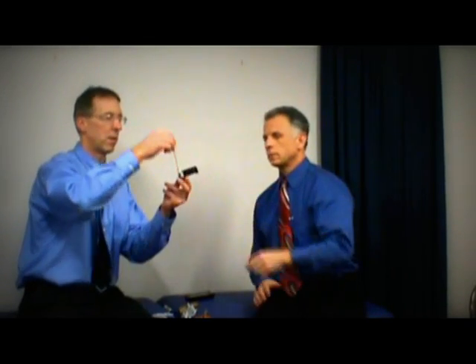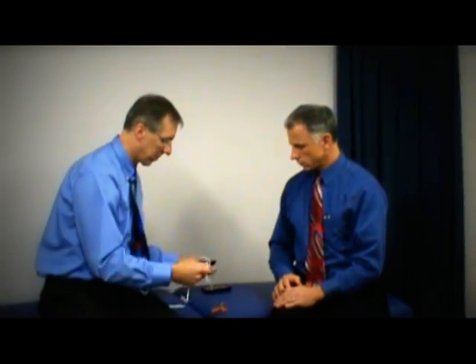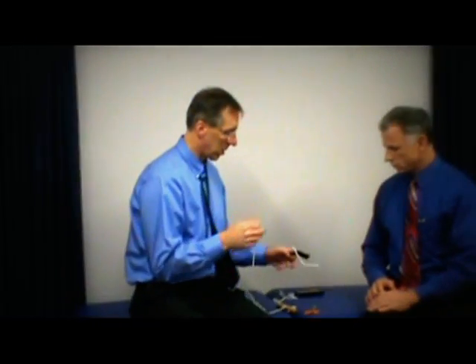You're going to show how it works? Yeah, we might as well. So pretty. So there's the pulley, that thing with Bob made the nice knot. I'm going to put 2 1/2 inches in there to secure it. Okay. All right, so we got the little string holding the pulley system. Now you're going to take a longer piece of nylon rope, because that's got the smooth, slippery surface, right? And you're going to feed it through on the pulley.